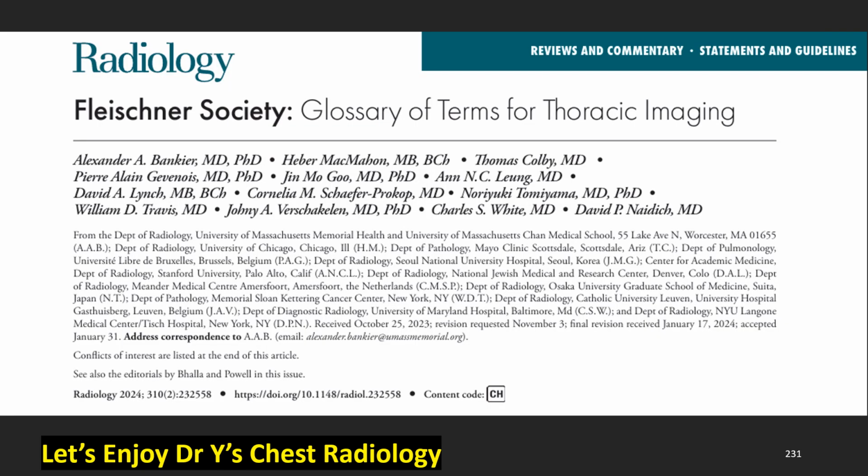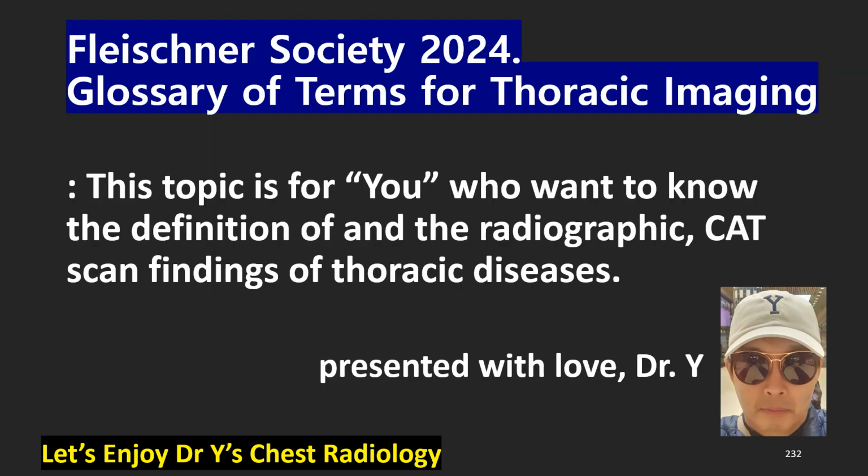This topic is based on the Radiology Reviews and Commentary, Statements and Guidelines: Fleischner Society Glossary of Terms for Thoracic Imaging by Alexander A. Bankier et al., Radiology 2024, 310. This topic is for those who want to know the definition of and the radiographic and CT findings of thoracic diseases.